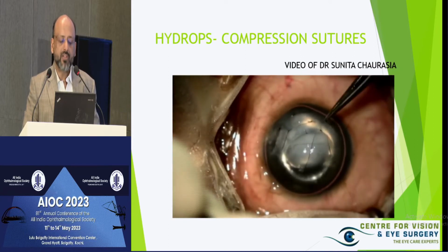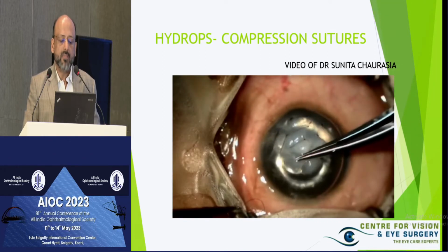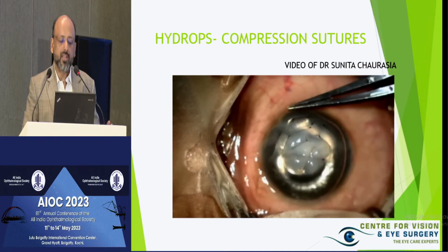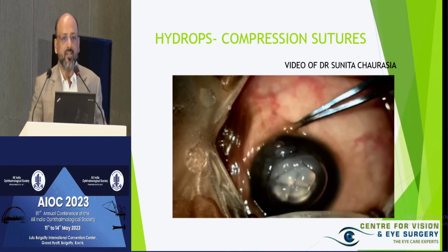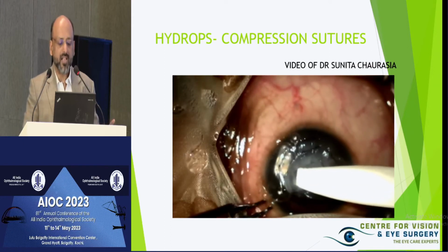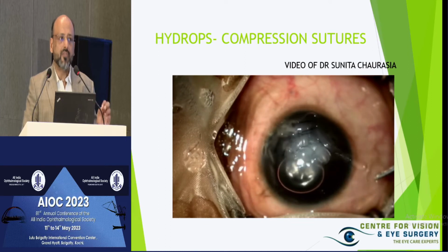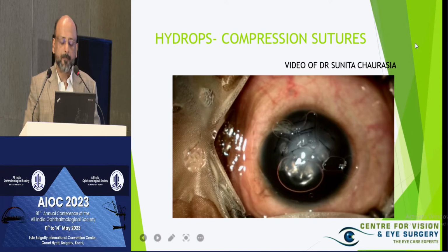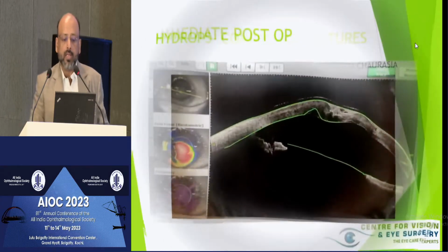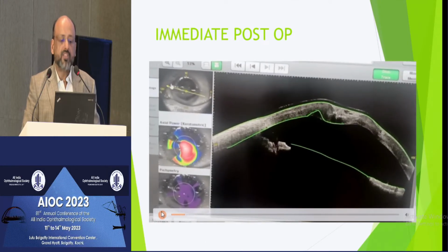And in fact, on table, you find a lot of them actually start clearing up. Now, the aim is basically to make sure that the fluid in the cornea comes out very significantly. You can use air. I prefer to use SF6 for large detachments like the patient that I showed you on presentation. If you've got full thickness perforations and if you have actually relaxed the cone, a good idea would be to actually use glue.